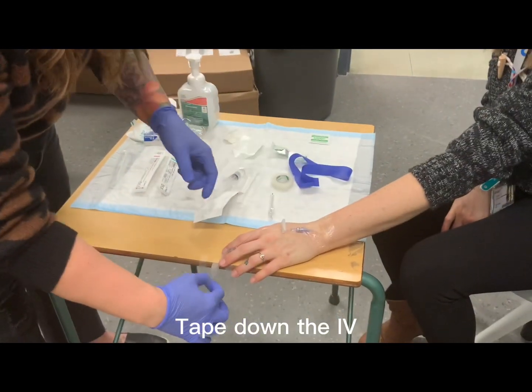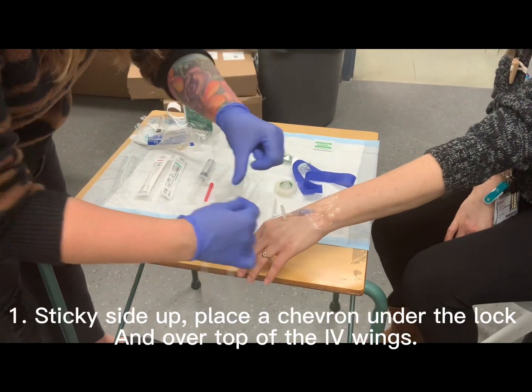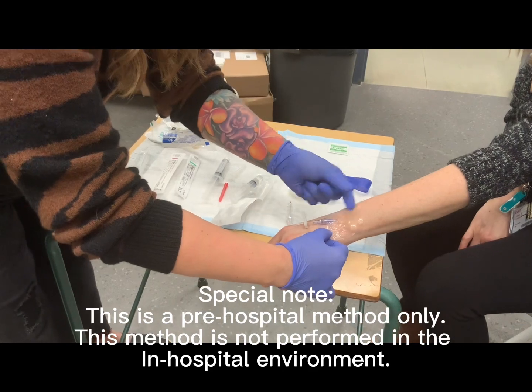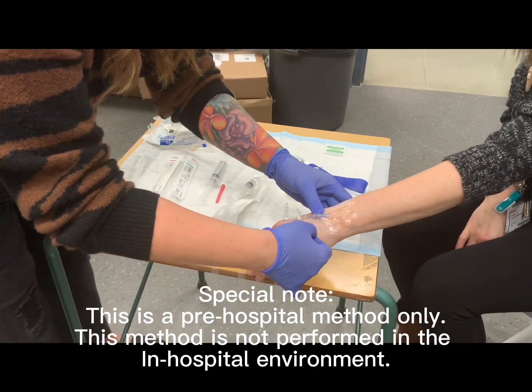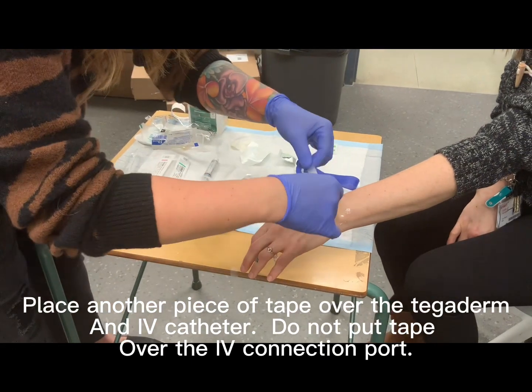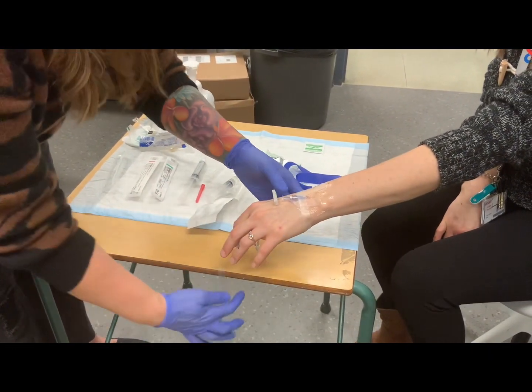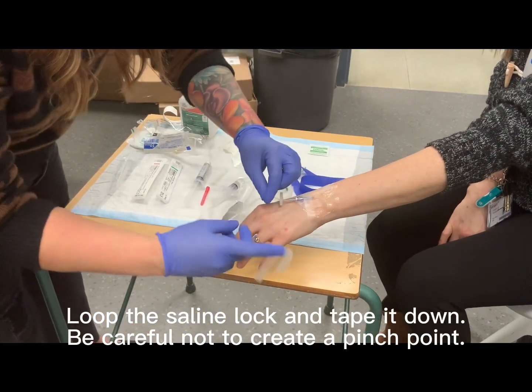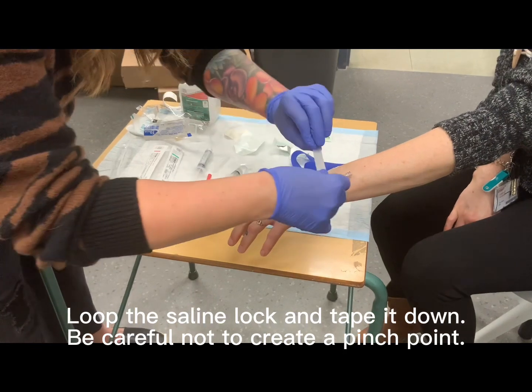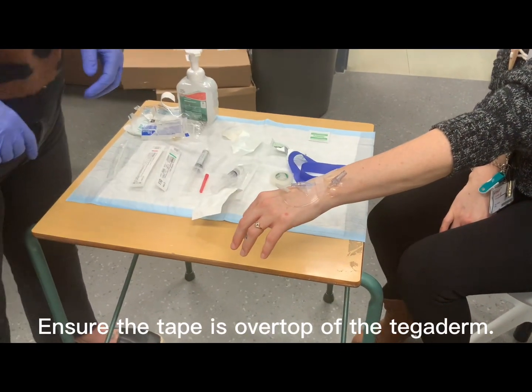Prepare your tape. It is now time to tape down the IV. Pre-hospitally, we will utilize a chevron, which is what's demonstrated currently. The in-hospital method does not utilize this piece of tape, but the next two pieces of tape are placed as seen in the in-hospital environment. When pulling the loop around, ensure that you do not pull it so tight that you create a pinch point. Most of your tape should be over top the tegaderm.